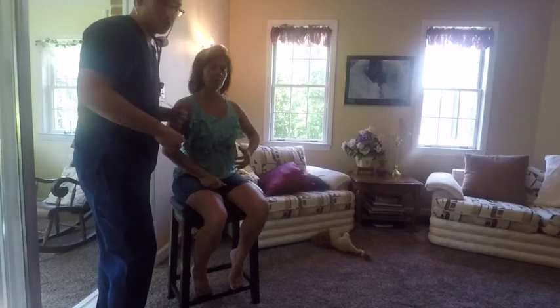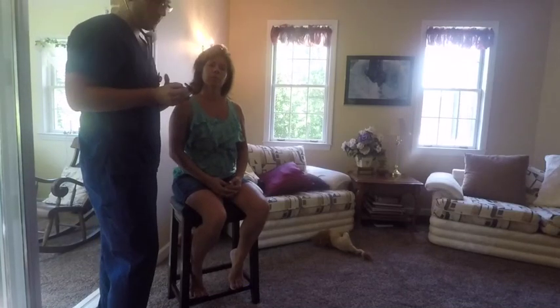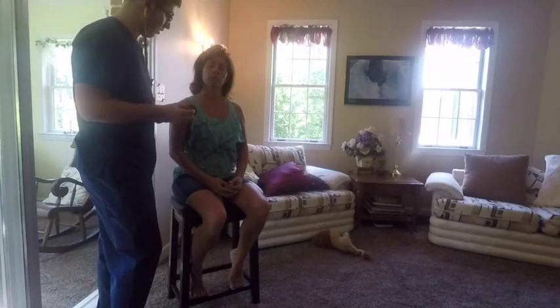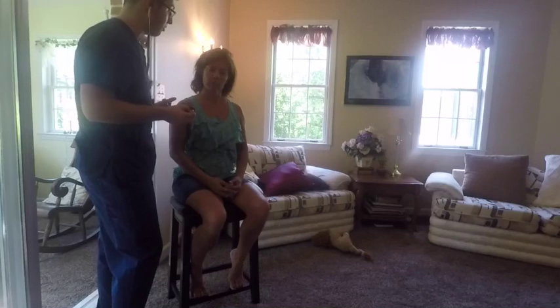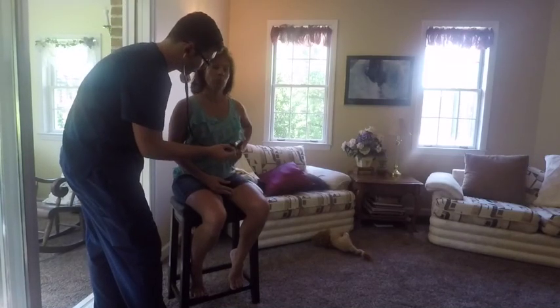So I had initially listened to all of those spots with the diaphragm of my stethoscope, and I will now go back through with the bell of my stethoscope, listening for a lower frequency in sound, which could show me that you would have a murmur in one of those heart valves. So I'm going to ask you to lift up your breast for me again.